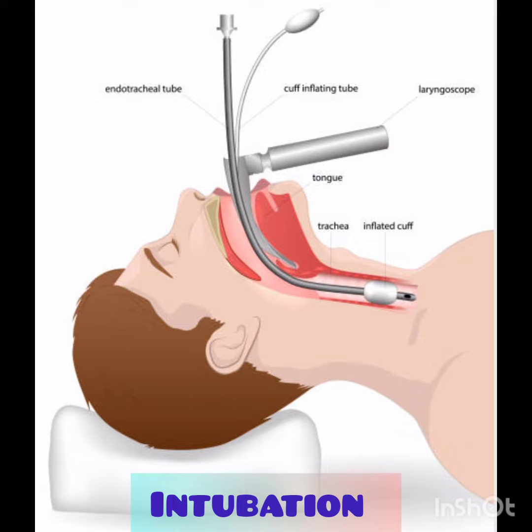So intubation is a medical procedure that involves inserting a flexible plastic tube down a patient's throat. It can be done in operating rooms and also in emergency rooms. The primary purposes of intubation are to open up the airway, to give oxygen, to remove blockages, and to prevent lung collapse, heart failure, trauma, etc.